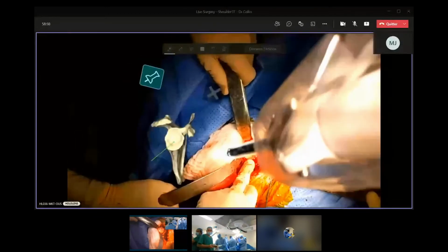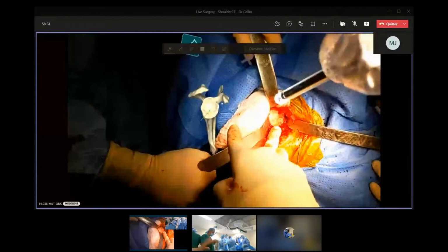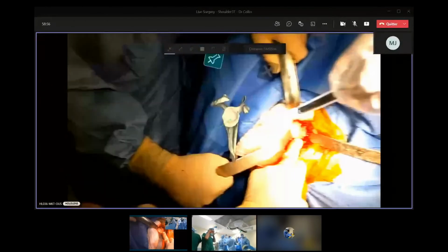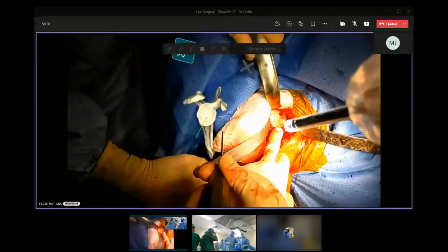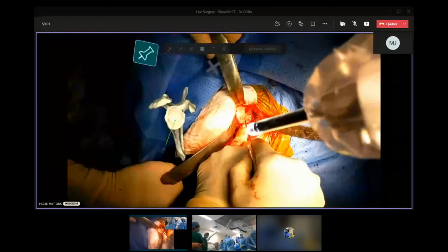Like this. You see here? So I want to reproduce this here. Like this.